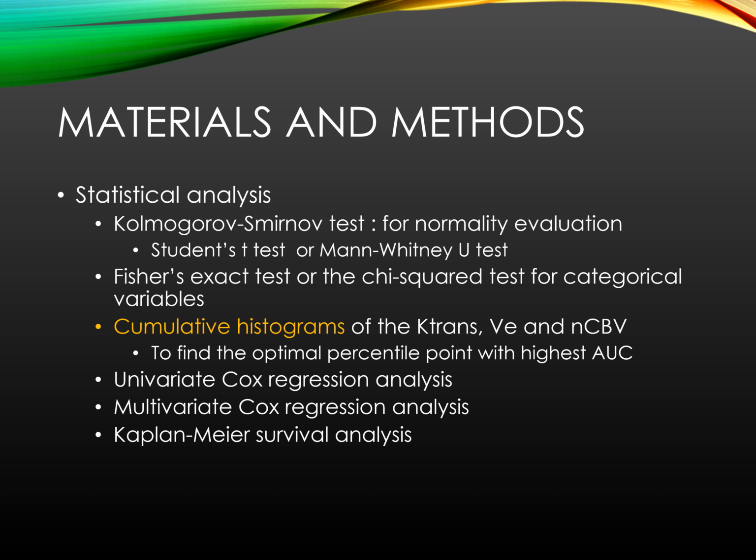Cumulative histograms of K-trans, Ve, and nCBV were used to find the optimal percentile point with the highest AUC. Afterward, survival analysis was performed using Cox regression and Kaplan-Meier survival analysis.